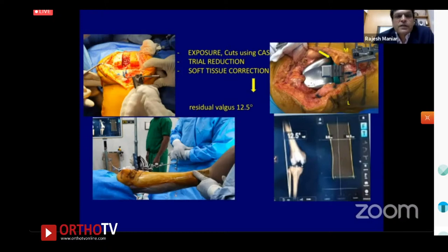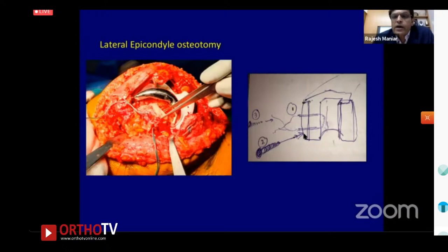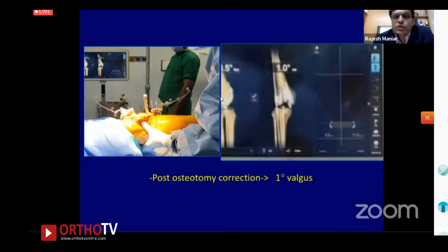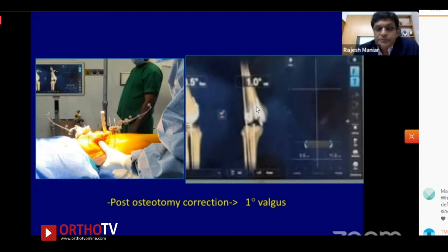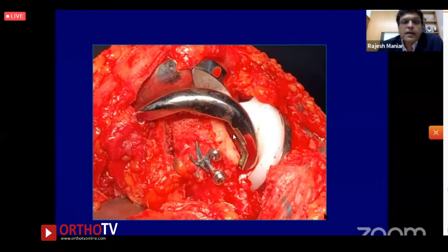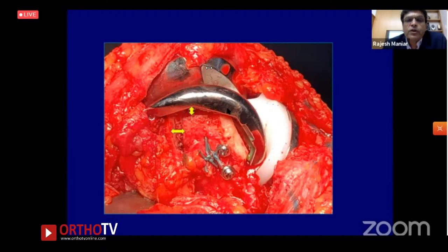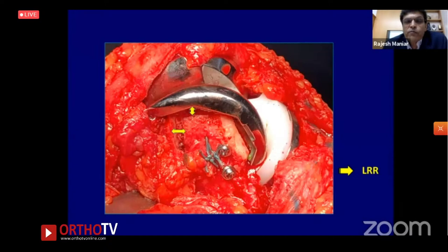The lateral epicondylar osteotomy is performed. Two temporary K-wires are passed through the notch — using a PS system, the notch gives access — to temporarily hold the osteotomy in place. Two definitive screws are then placed. The alignment comes down to minus one degree, which is my target for valgus. The osteotomy fragment was moved more distally than posteriorly, exactly as much as needed.